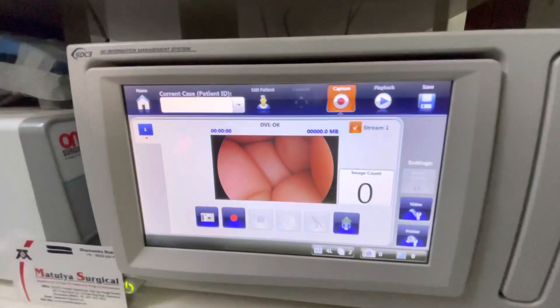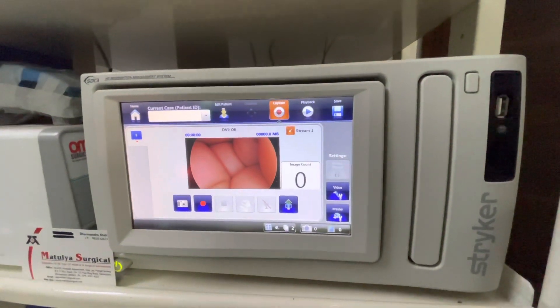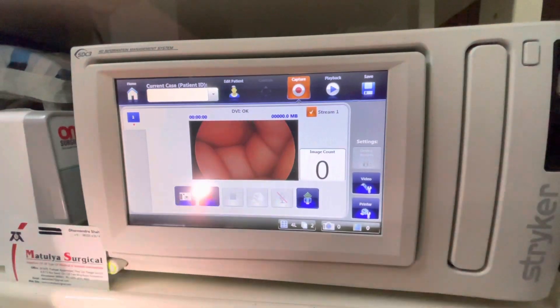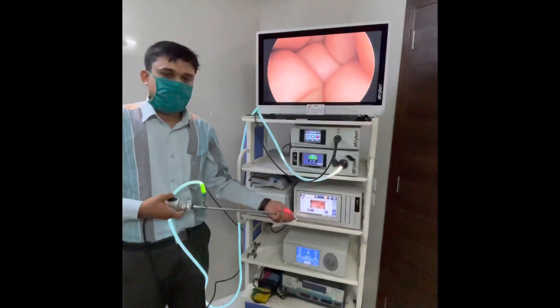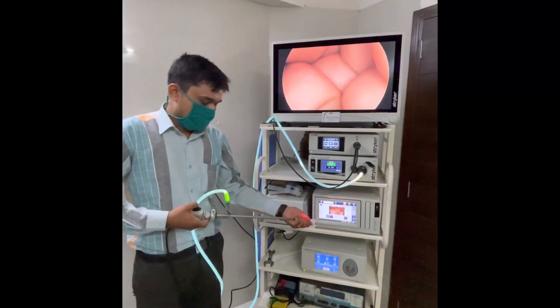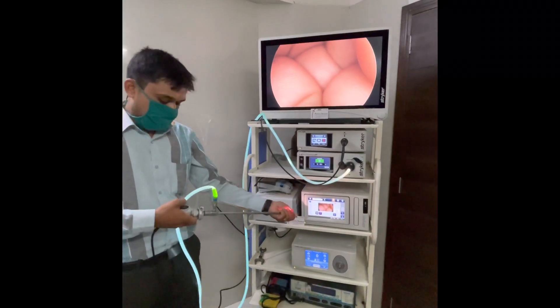Hello guys, today we have the Stryker SDC3 HD recording management system. You can see live recording through this display. You can also operate this Stryker recorder with your camera head — you can capture images and start recording.